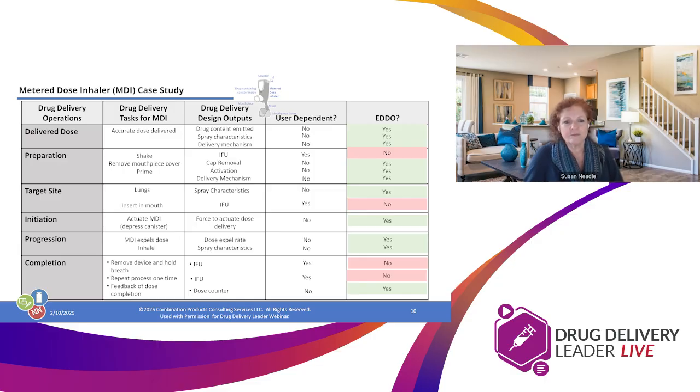Well, here we go. We need the accurate dose delivered. And the design outputs are going to be the drug content that's emitted, your spray characteristics, the delivery mechanism, and are they user dependent? Well, first one's not, second one's not, and the third one's not. So yes, they're all EDDOs, okay?